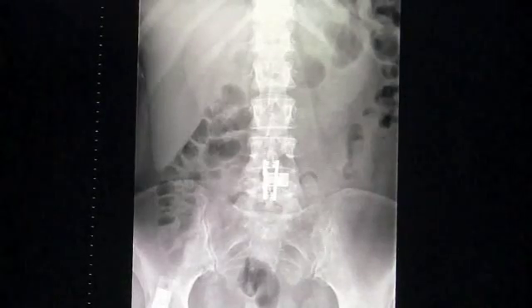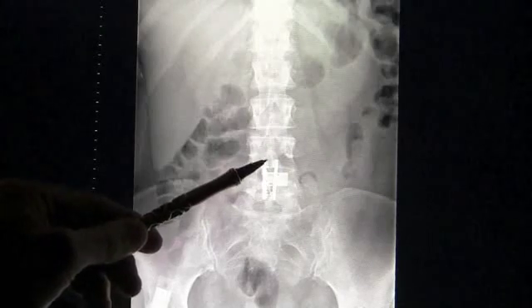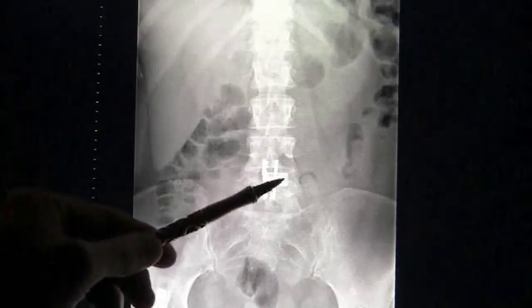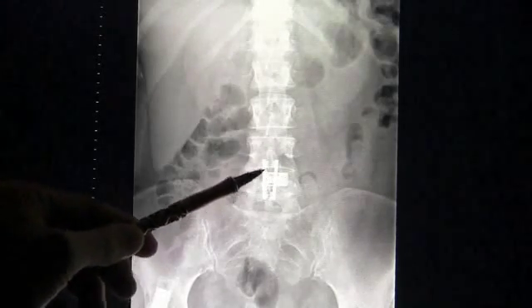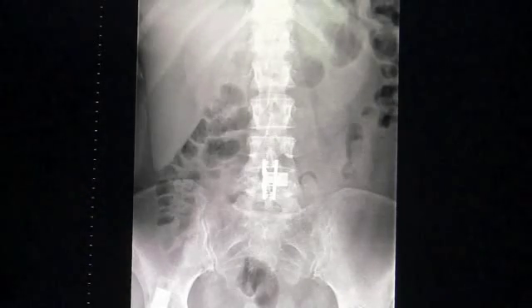The surgery itself takes about an hour and a half to an hour and 45 minutes. The patient goes home typically in the afternoon. This is an AP view of the clamp in place across the spinous process, allowing for stabilization and fusion.